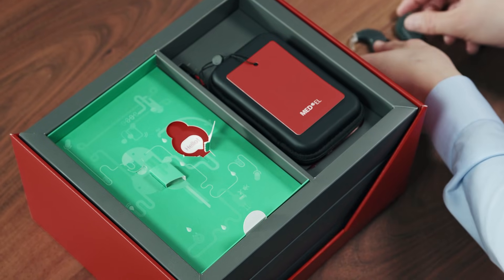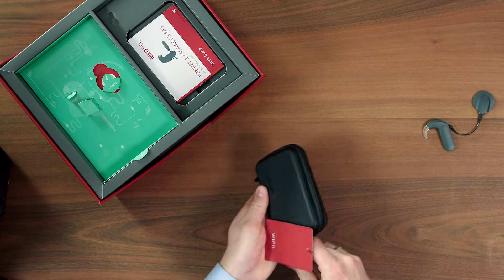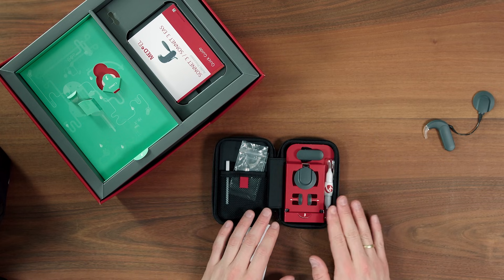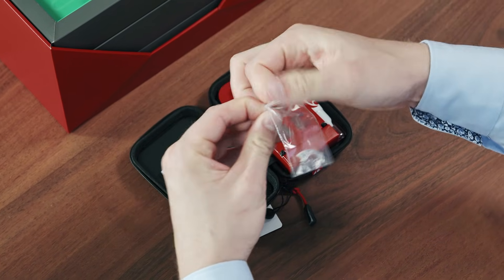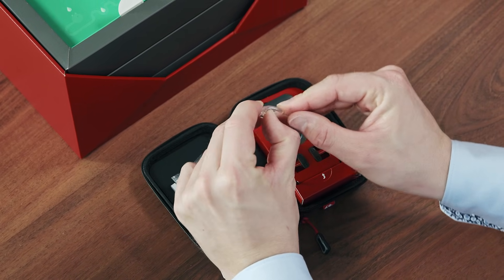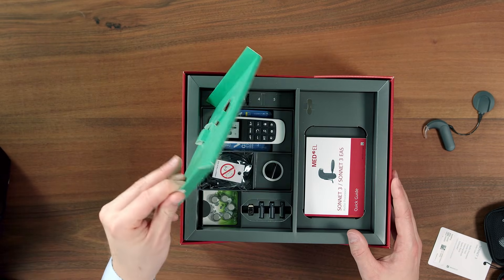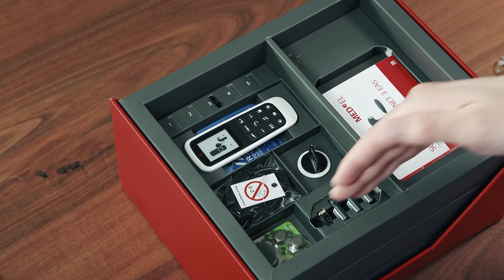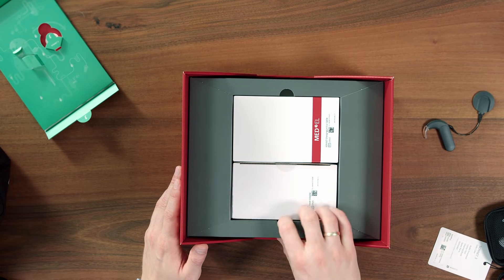Sonnet 3 comes with several accessories. Here is the daily case. It contains spare covers and some helpful tools, as well as the new flexible silicone earhook. It bends to fit your ear for added security and comfort. And in this layer are the magnet, the fine-tuner echo remote control and the battery options. And here we have the charger for the rechargeable batteries and the drying kit.